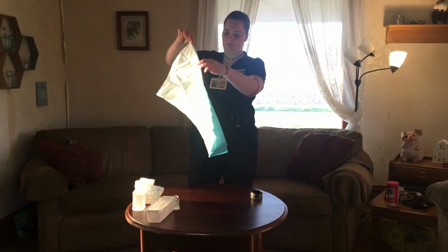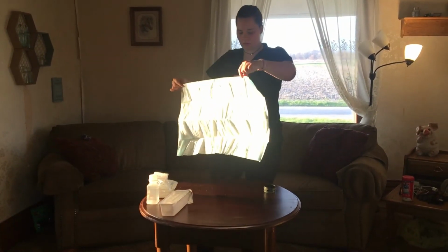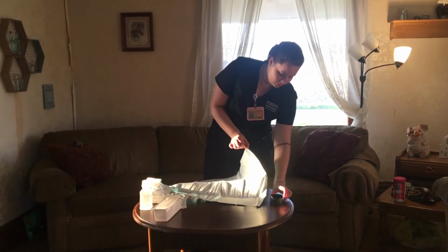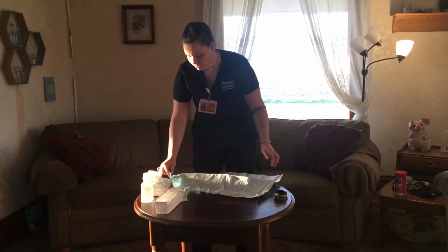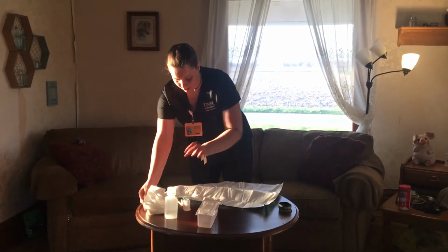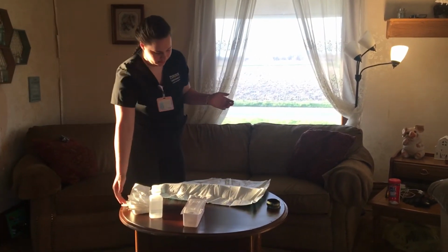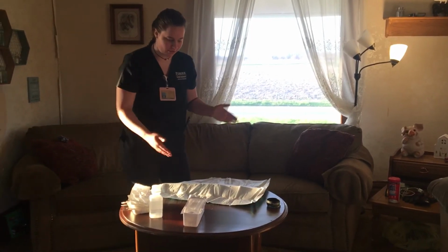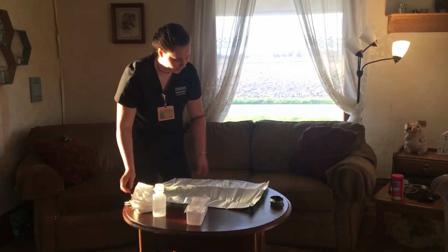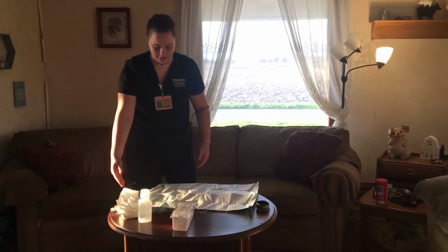And you can touch your 1-inch border. Again, you're touching your 1-inch border. You don't want to reach over your sterile field, which I just did. That would break sterility, so you want to reach around and never turn your back to it. So obviously I'd get a new sterile field, but this is the only one I have, so we'll pretend like I got a new one. You can reach to the sides of it and everything.